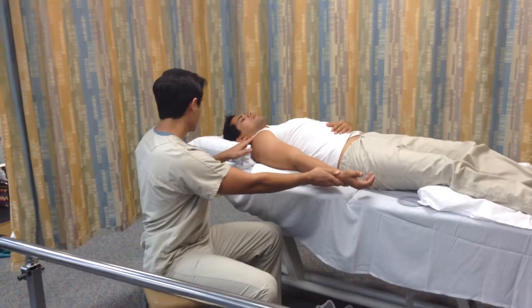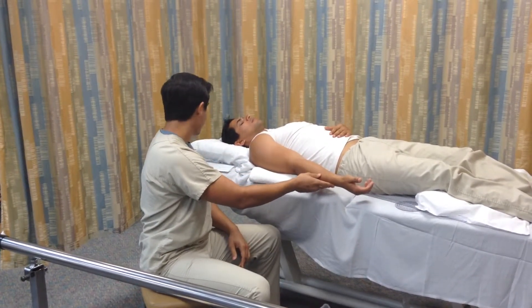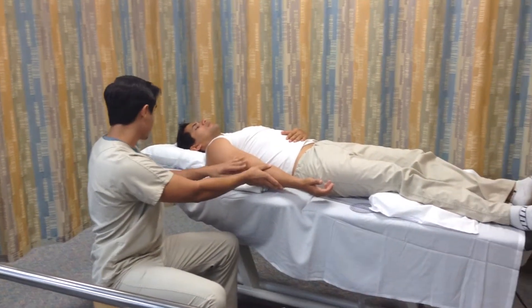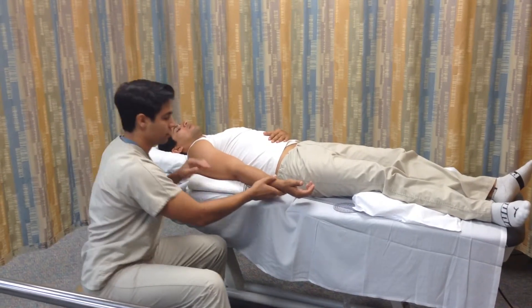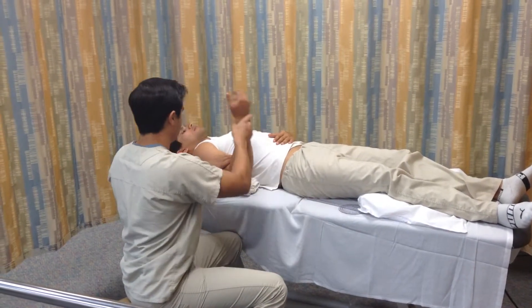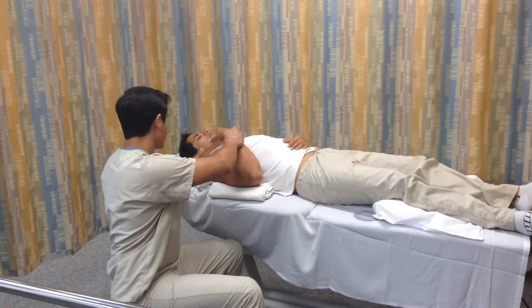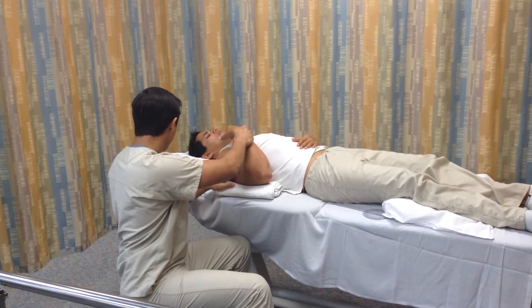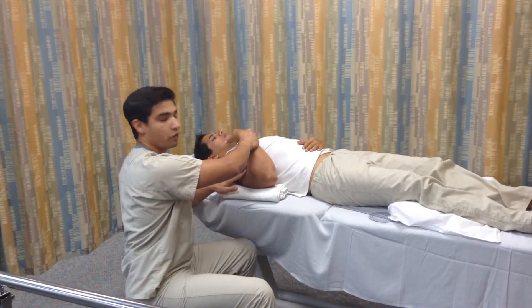To begin, we'll place the patient in the testing position, with the arm at zero degrees of abduction. Then we'll go ahead and move the patient through the available range of motion. We'll make a visual estimate and determine the end feel, which is soft. The visual estimate looks to be about 140 degrees or so.